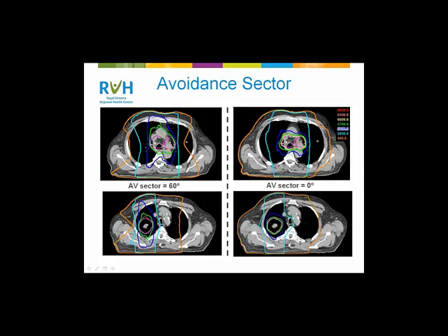Have your plan QA services allowed QA of the arc plans to offset the planning time? Oh, excellent question. Yes, we do have additional QA time now because we do phantom QA using Sun Nuclear's ArcCheck device for all of these plans. And that's an important balance to consider when you're doing this, because we're trading off dosimetry time for QA after hours. And I feel comfortable saying this in a crowd like this, but we felt the dosimetry time was more valuable than the QA time. Really what I mean there is we had more resources for QA time after hours. So it was a good shift and a good way for us to free up planning time.